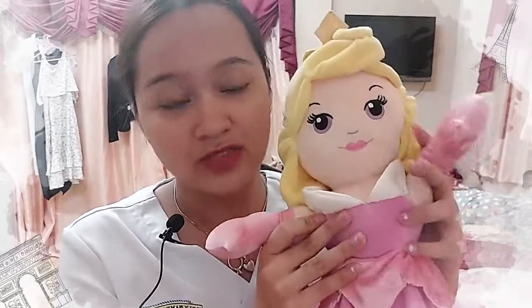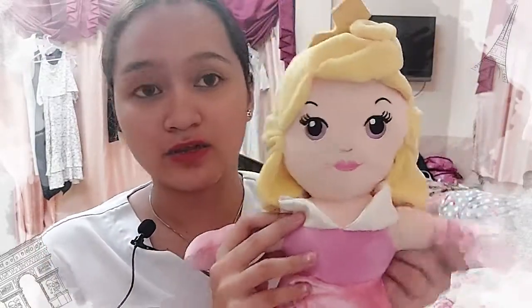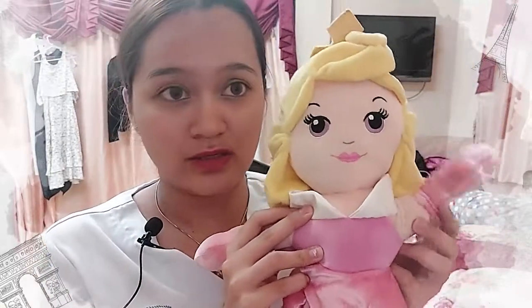For intradermal injection, I need to provide privacy to my client, perform hand hygiene, wear clean gloves or you may not, and then prepare the client. Identify the client: Hi Ms. Aurora, how are you feeling today? Explain the procedure to her: Ms. Aurora, I will be performing an intradermal injection on you. Position her — she can sit down for this injection. Ask if she's right-handed so I can do it at her non-dominant hand. The left arm is for tuberculosis, and other allergy tests can be done on the right arm.